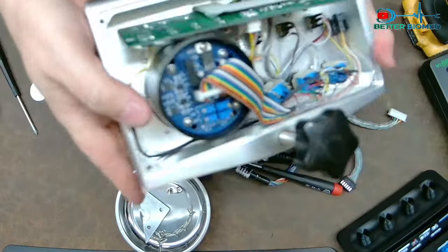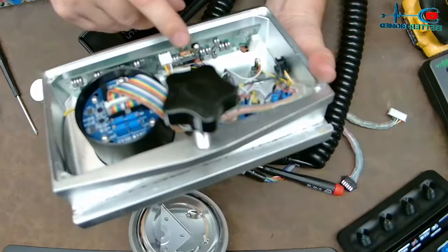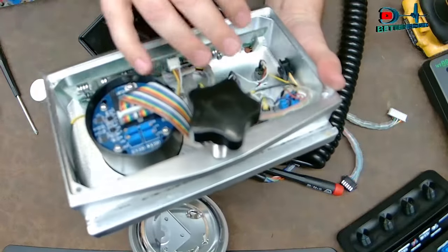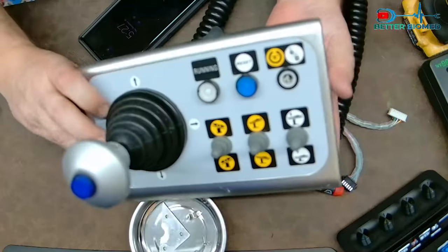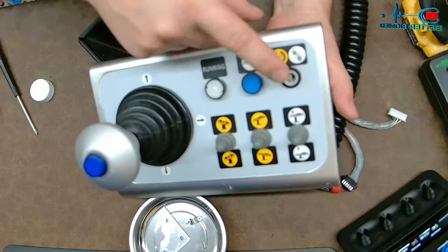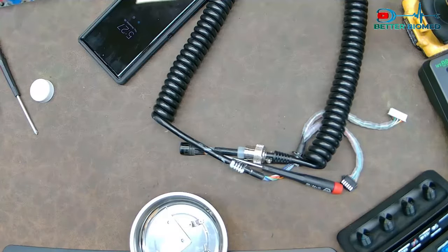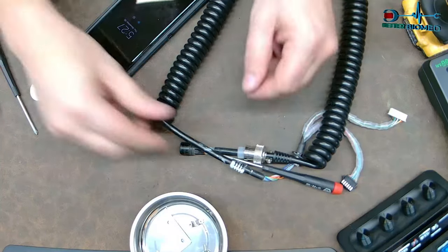Here is the inside of the controller. This right here is the joystick, and this board right here is for all the push buttons — to which I'm missing some things. That means I've got to order some more buttons. Lovely. Okay, back to what we're doing — the cord.